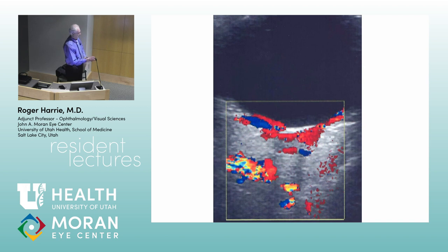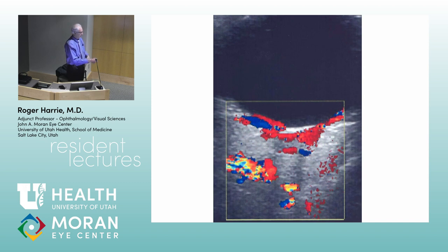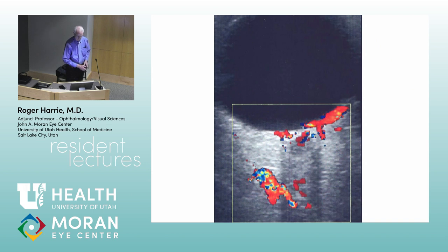A normal Doppler shows the globe, then behind it the optic nerve shadow, the ophthalmic artery, central retinal artery, central retinal vein, and ciliary arteries. In a hemi-central artery occlusion, you can see one part is dead — the blood flow is gone — while the rest of the area is still vascularized, demonstrating the hemi pattern clearly.